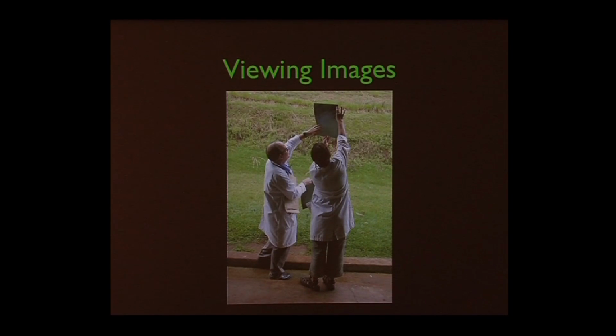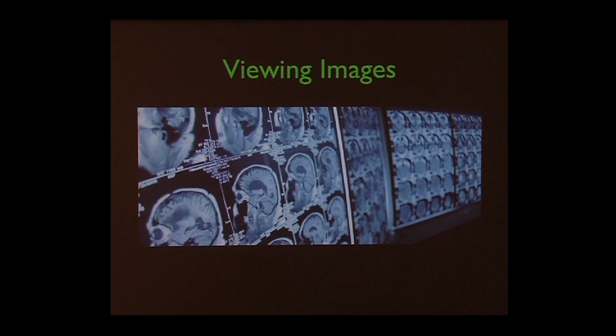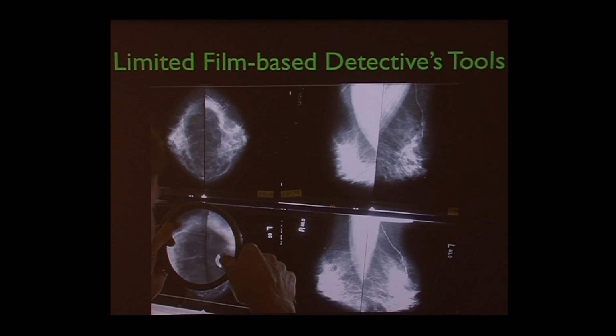And you could take them anywhere. There was a light source, so you could do a curbside consult out in the light. Then when we got imaging with more and more images associated with it, we needed some way to display them. This is before there were computer workstations. So they were filmed as little images on big films, and we had view boxes all over the place to compare. Let me show you in a minute some of the chaos that we went through in those days.